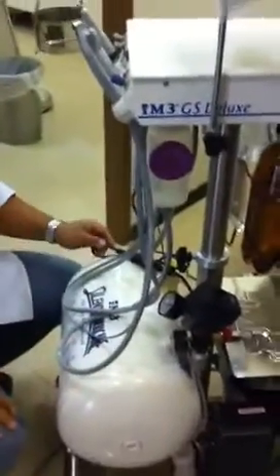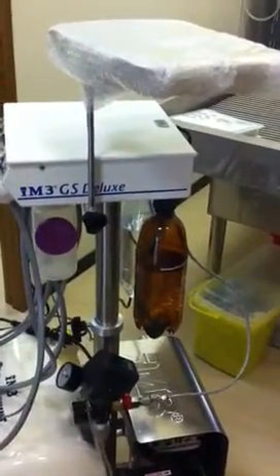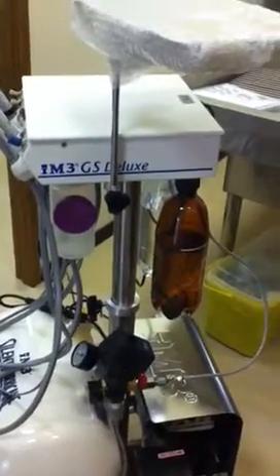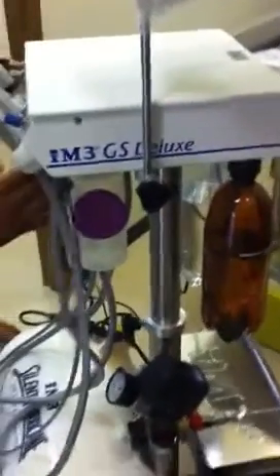You can buy the big one. iM3 recommends distilled water solely because tap water has minerals that will clog the piping over time. This would be the exhaust, I'll explain the exhaust.